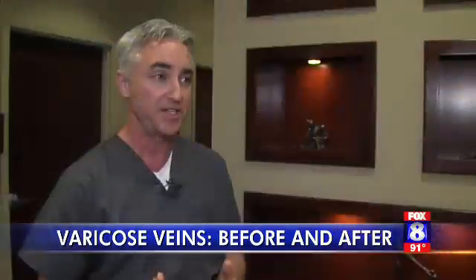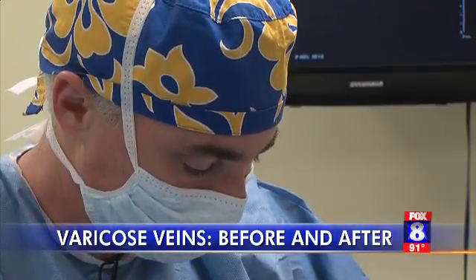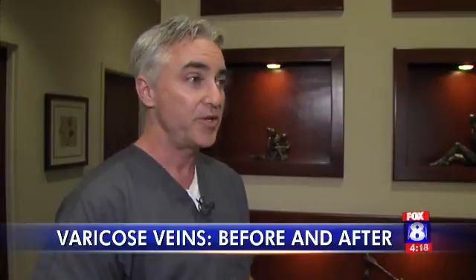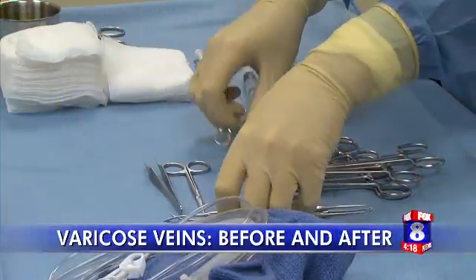The old way of doing things doesn't exist. What your grandma had done is not what we're doing anymore. Enter Dr. Brent Greenberg, who told me about a new procedure called ClaraVein. Today we're using a technology that instead of using any heat, uses a spinning wire that rapidly spins inside the lining of the vein and causes it to collapse from the inside. And here's the deal — no anesthesia is needed.